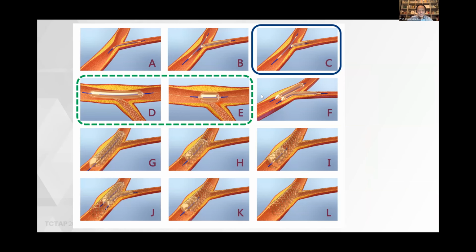For example, immediately after stenting the side branch, usually we can use a stent balloon to optimize the side stent. But for a large side branch, particularly for side branches taken from the proximal, the stent balloon is still undersized for the proximal side branch. We have to use another large non-compliant balloon to do an optimization for the side stent. A second point is that because the first balloon for crushing the stent is undersized for the proximal main vessel, we had to use another large non-compliant balloon to further crush the side stent. The third point is we recommend always rewiring to the side branch from the proximal to middle cell to avoid rewiring from the distal cell. I think these are only 3 key steps for DK crush.